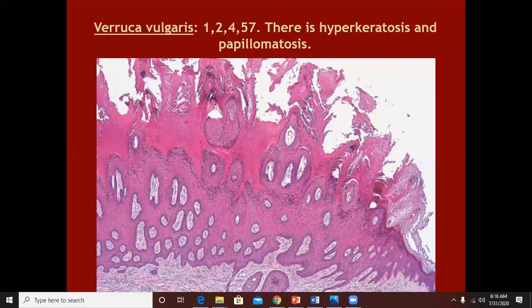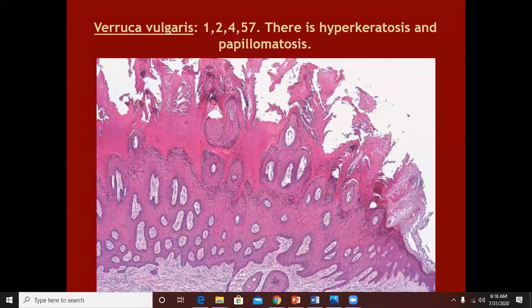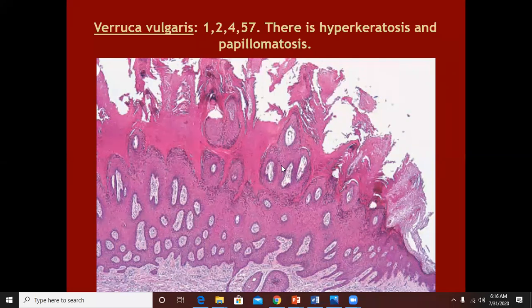You can see papillomatosis in other hyperkeratotic lesions — for example in seborrheic keratosis, in verrucous epidermal nevus, in sebaceous nevus, and in hyperkeratotic actinic keratosis. In all these cases, you will see hyperkeratosis as well as papillomatosis.